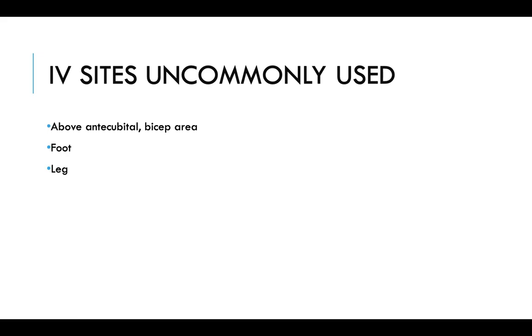potentially not being the direct reason that they lose a limb, but anything that we do that disrupts blood flow to an already poorly perfused area could cause need for amputation and further damage down the line. So really take into account the responsibility you're putting on the team with starting an IV in somebody's foot or leg if it's for a diabetic patient.